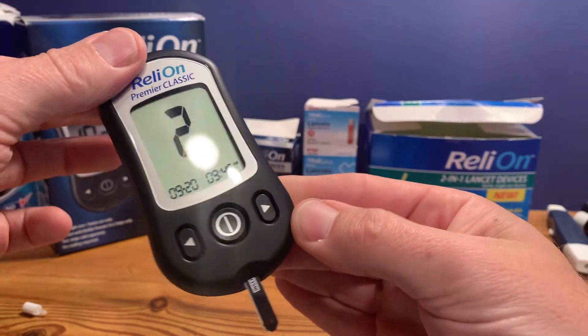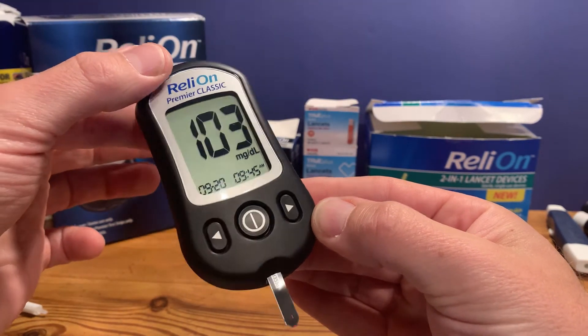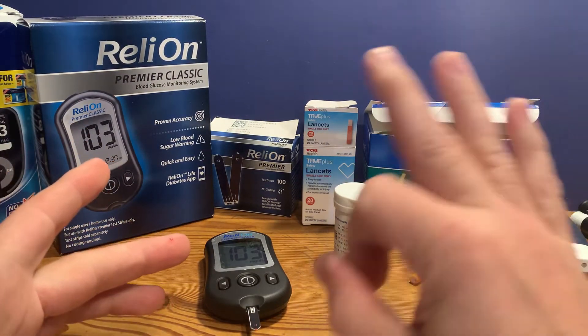There's our reading: 103. Testing is pretty simple at home — you just need the three things: a lancet device, the appropriate test strips for your meter, and the meter.